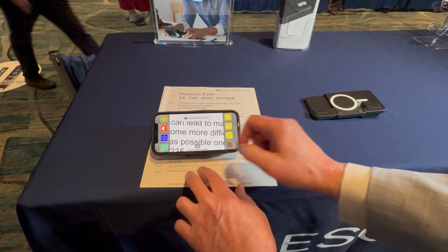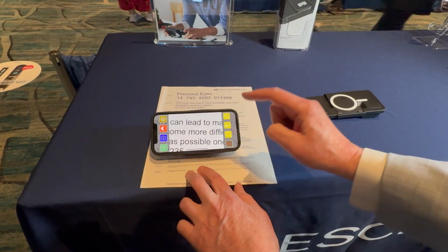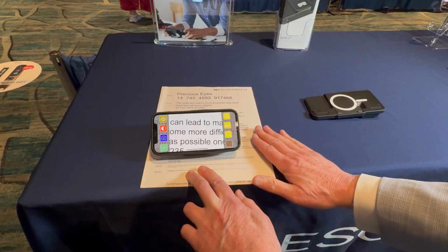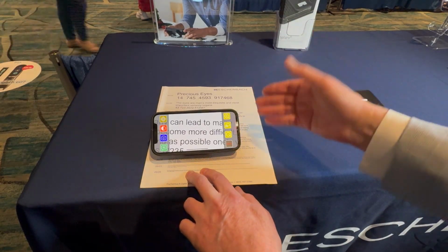The nice thing too, it says camera battery 94%. That's actually the camera battery of the Optaro battery. So Optaro does not use the battery of your iPhone, it doesn't drain it.